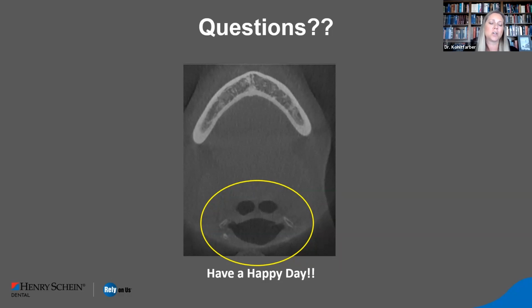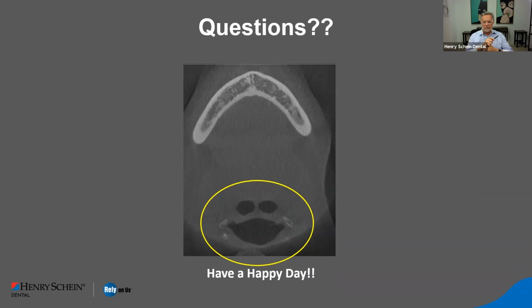So, I have to show you what the 3D selection criteria says, what is being printed, what is out there. But also take into account what the doses are with CBCT now, and for bite wings, it's very similar to what we had before, and we have a lot more information. We're seeing many people move towards a CBCT and 4 bite wings as their full mouth series. And I don't think that's bad.